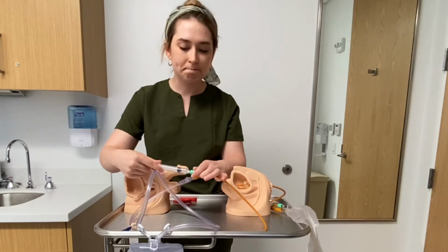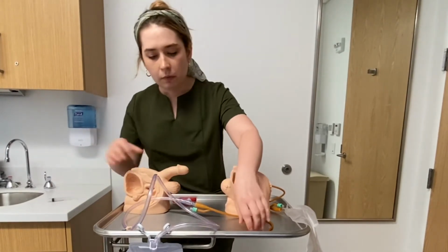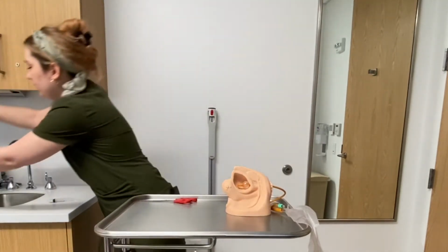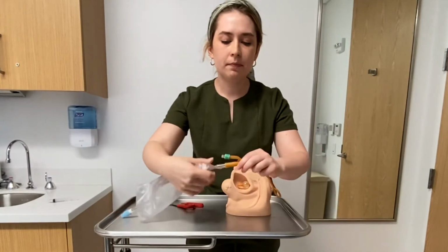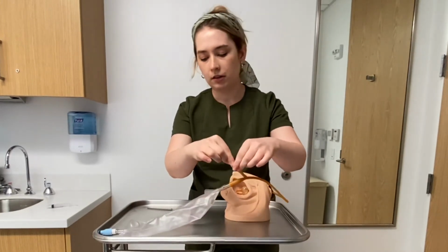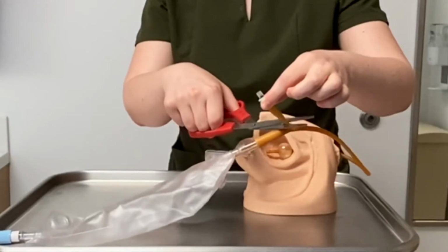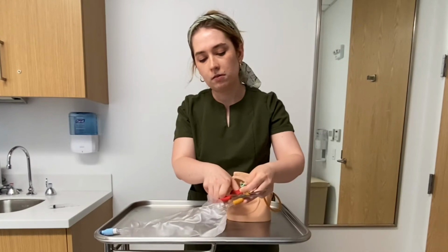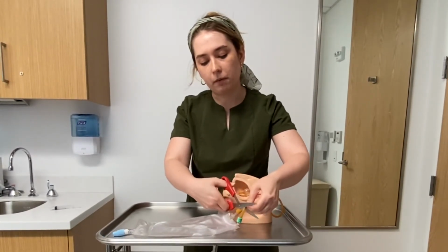Now, if you're at home and you do not have a syringe, we can easily also remove the catheter with a scissor. So, grabbing the same end, you're going to take the colorful piece, you can hold it up, and all you're going to need to do is cut this piece with a scissor. It's a little bit difficult to start, but once you cut it, you are going to notice some fluid leaking from the catheter piece.